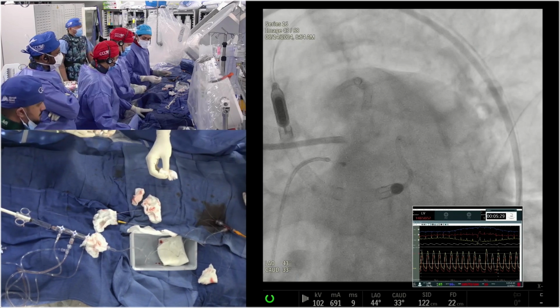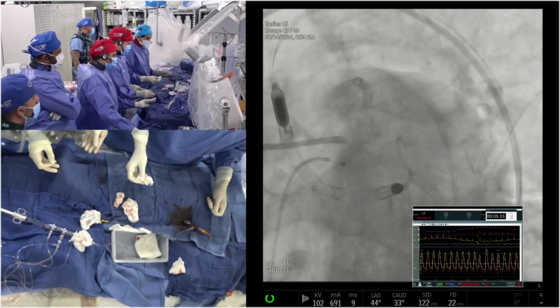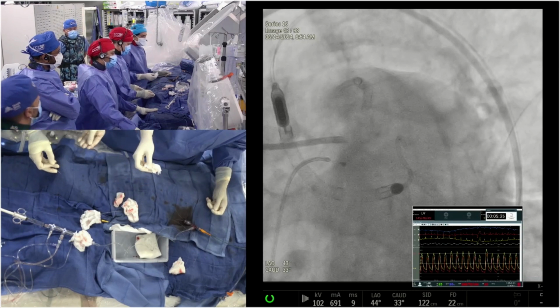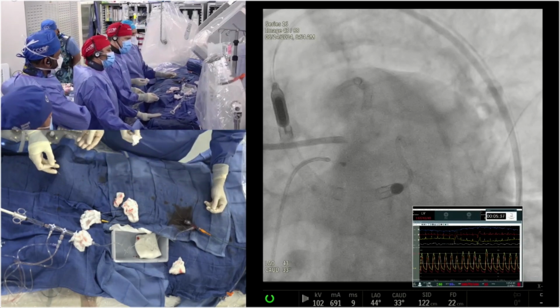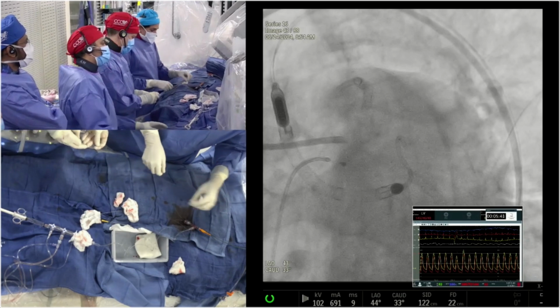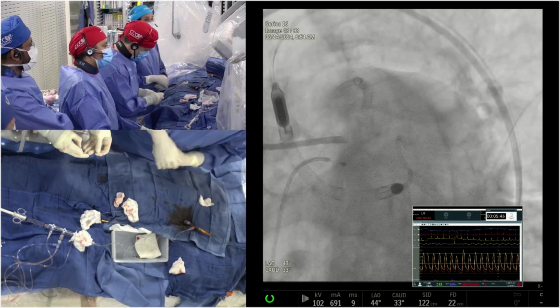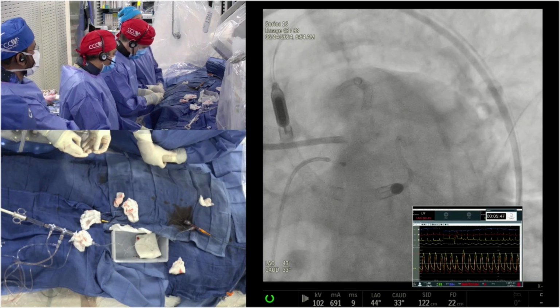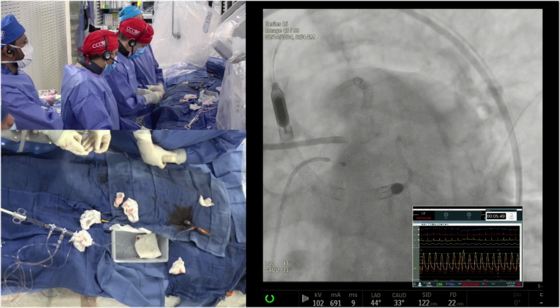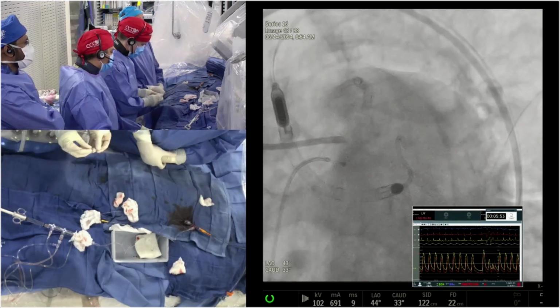Anu, was the gradient across the aortic valve too high before the balloon? Yeah, it was 30. We are down to like 12 now, post-BAV. We did a 20 millimeter balloon, yes. Yeah. And the hemodynamics look pretty good. The angiographic aspect of that ostium of the circ is always biased because of the cross-sectional view. When you do the IVUS, you can tell. So I will probably go with the conservative approach here.